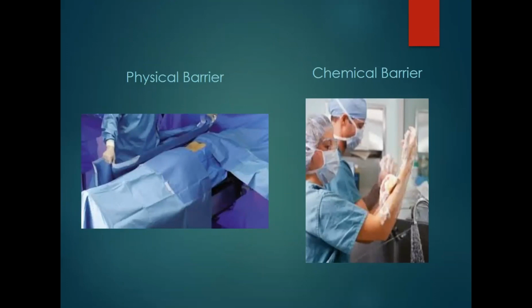When you go into the OR, like I said, you're going to walk in and most of the time the techs are going to be setting up the case. You're going to notice that they pull the tables and all of their sterile furniture at least a foot away from the wall. So we don't set up directly right next to the wall. It has to be at least a foot away from the wall.